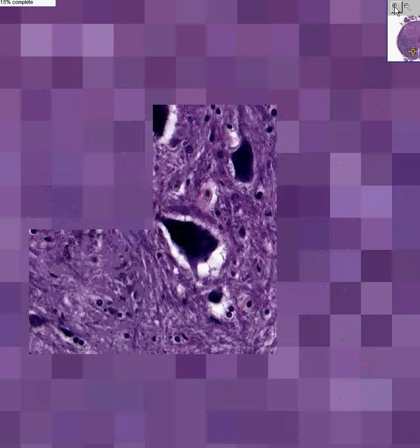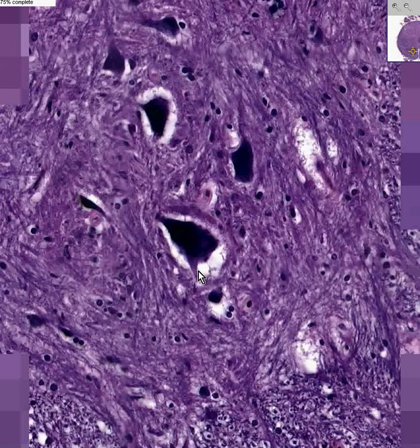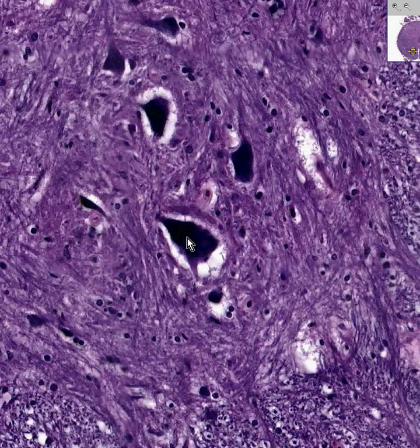The reason why you can barely see the nucleus within these large somas of the neurons is that it's totally obscured by Nissl substance. Classically, if Nissl substance would stop abruptly and then you see cytoplasm coming out of that, that's more likely to be an axon because Nissl substance extends into dendrites. All of these smaller cells surrounding these are astrocytes and oligodendrocytes.